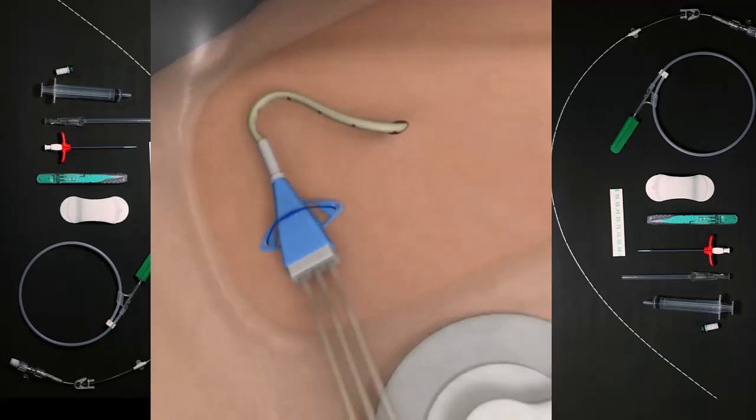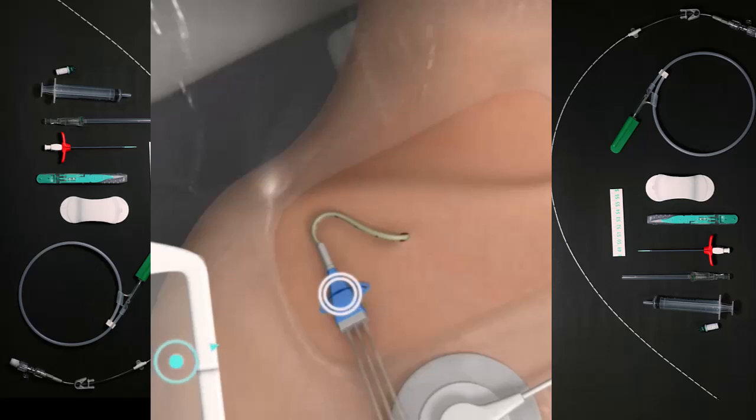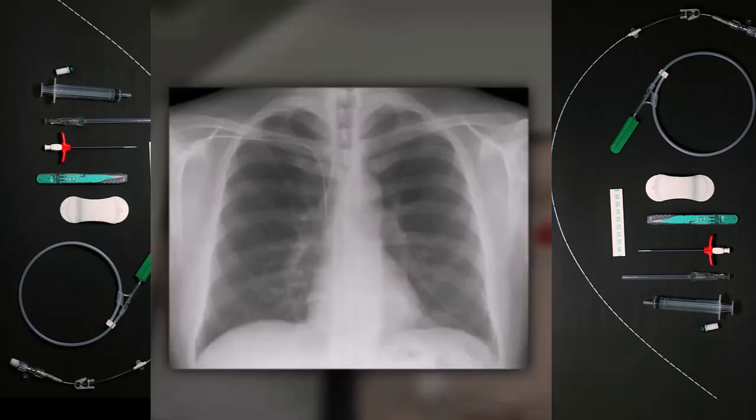Swipe to remove the guidewire and gauze while positioning the catheter for stabilization. Use the suture to secure the line in place. Obtain a chest x-ray to check the line placement and to confirm no hemothorax or pneumothorax has occurred.